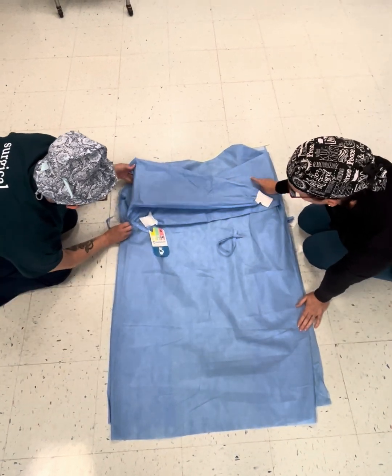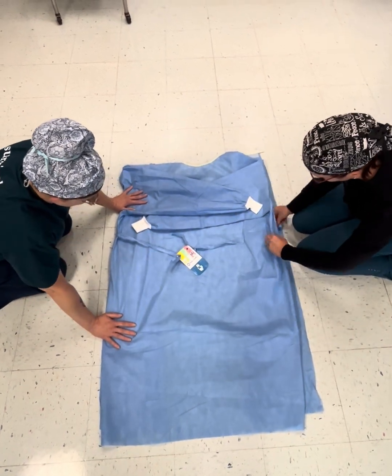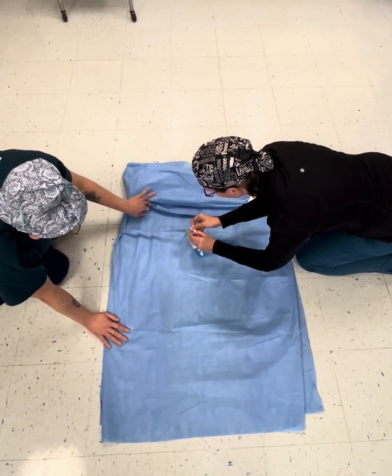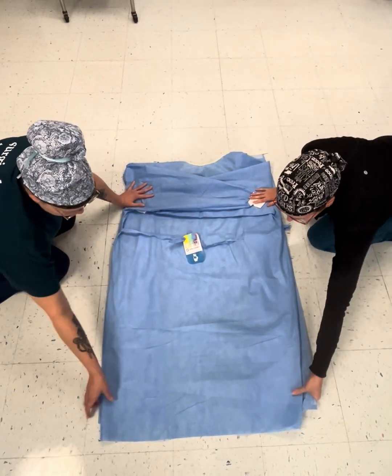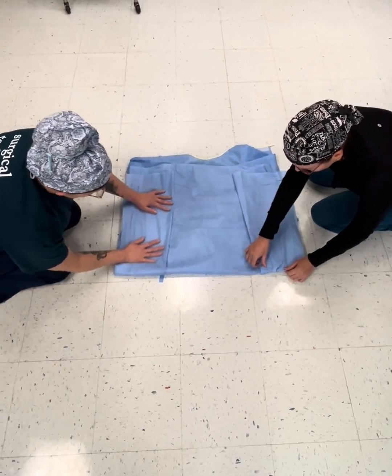So when you get to this point, make sure your string is the correct string, not the inner string. Go ahead and get this put together. Now come halfway up just under the neck. Do not come the whole way. Get all your air out.